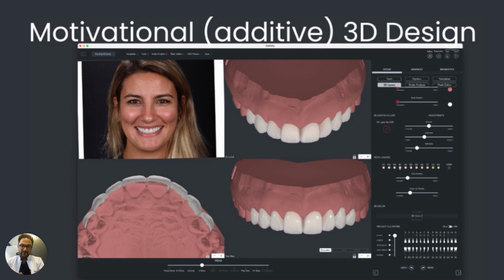So the Design4me service will allow you to request different types of dental wax-ups. I will give you here an overview of the types of dental wax-ups you can order from the Design4me by SmileFy, and what files you need to send to our smile designer so they have better information on what you're looking for. The first one that I will show you here is the Motivational wax-up.